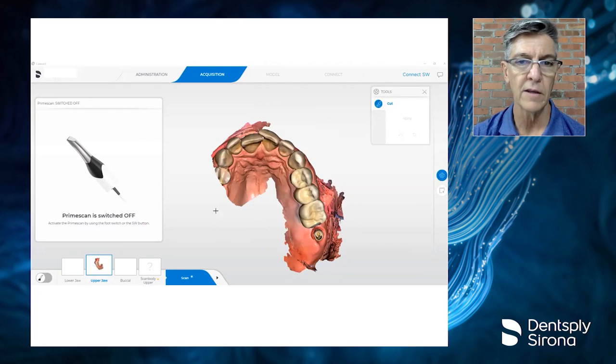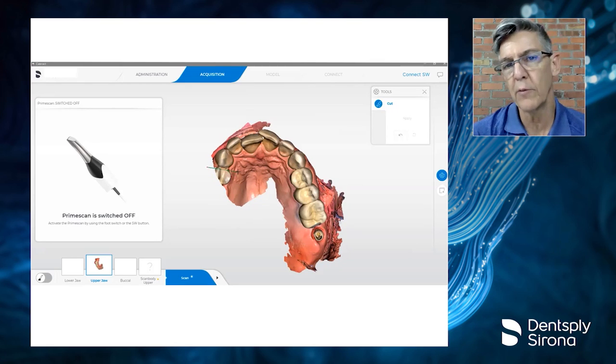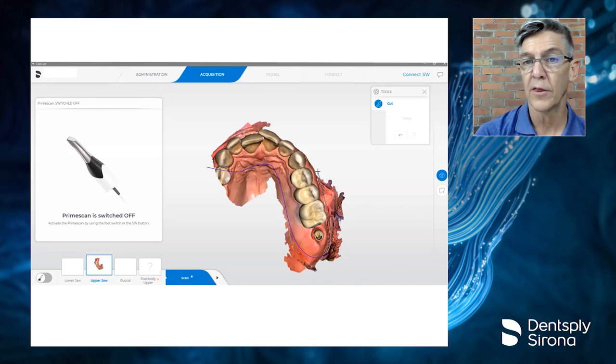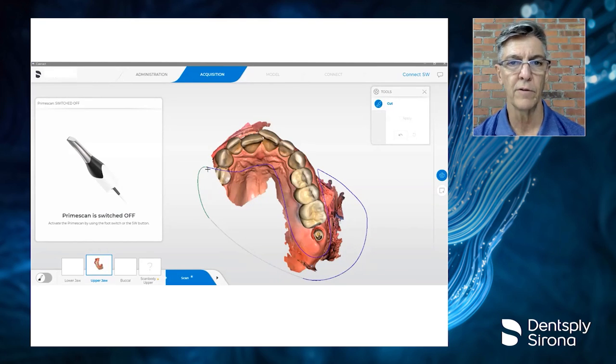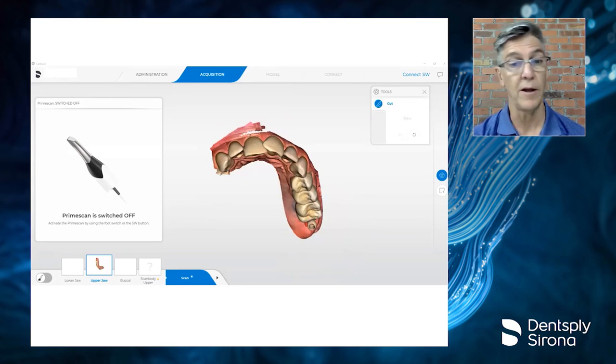Once I'm done with that, I'm going to trim away the overflow, what I would call overflow. It's what we would do if we had an impression, right? We have excess material. I'm going to do that with my scan. And the reason I'm doing this is that I'm going to order a 3D printed model, and I don't want a print of materials that are unimportant to the restoration of the implant. So we're just going to trim away stuff we don't need, bottom line.